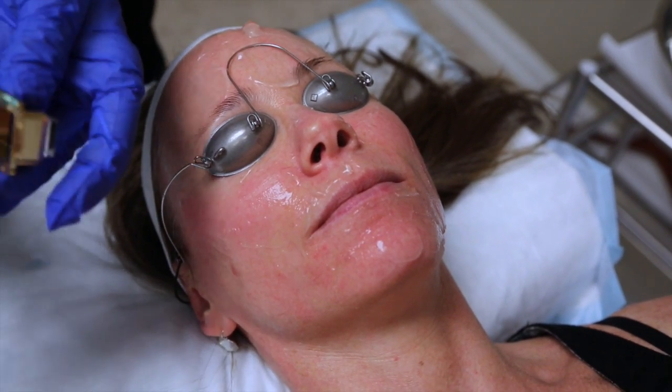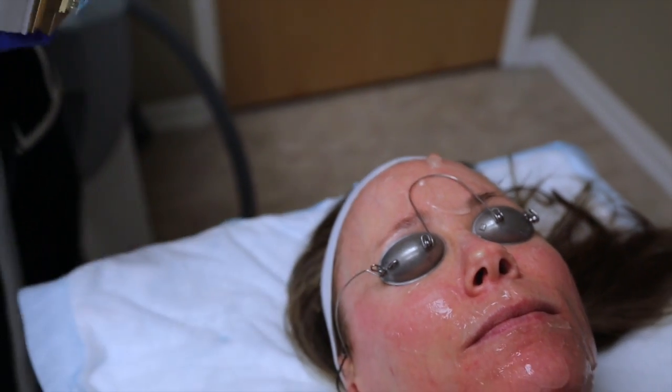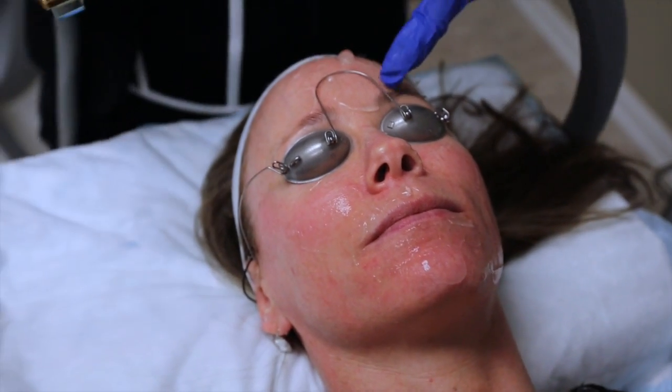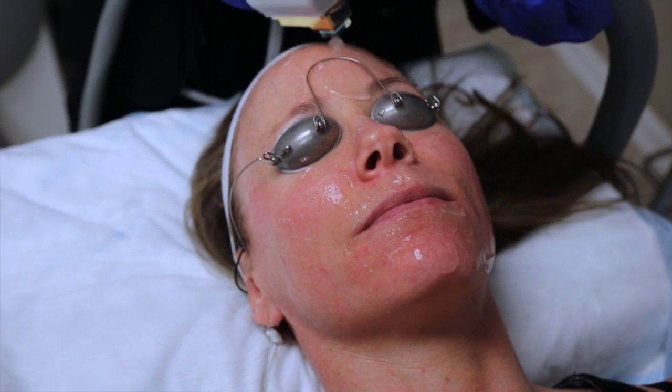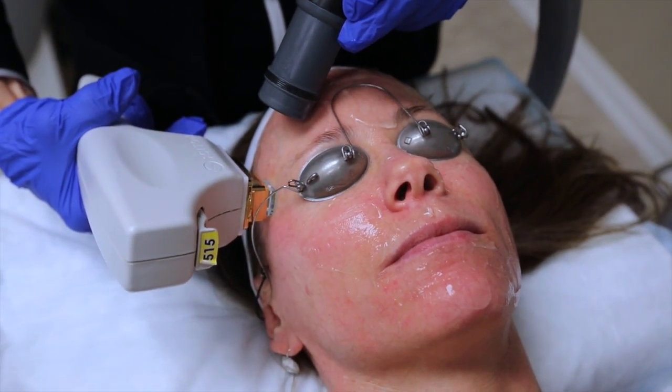So I'm applying this little adapter here, so that makes my treatment window smaller. And it allows me to treat the forehead and around the nose and upper lip.